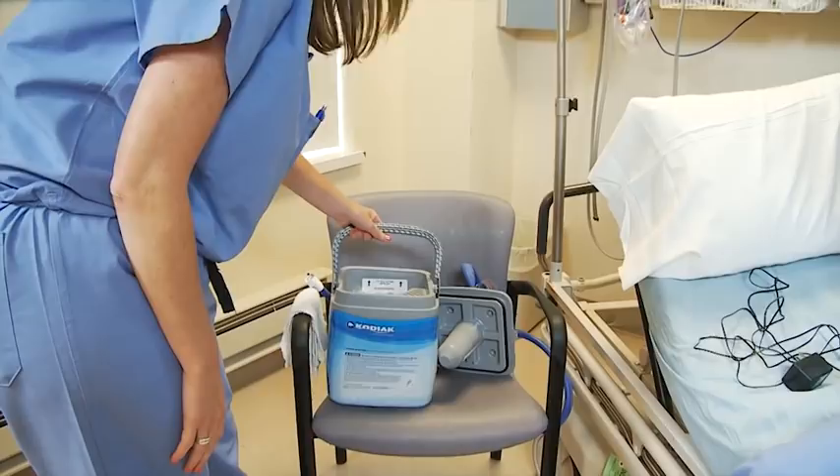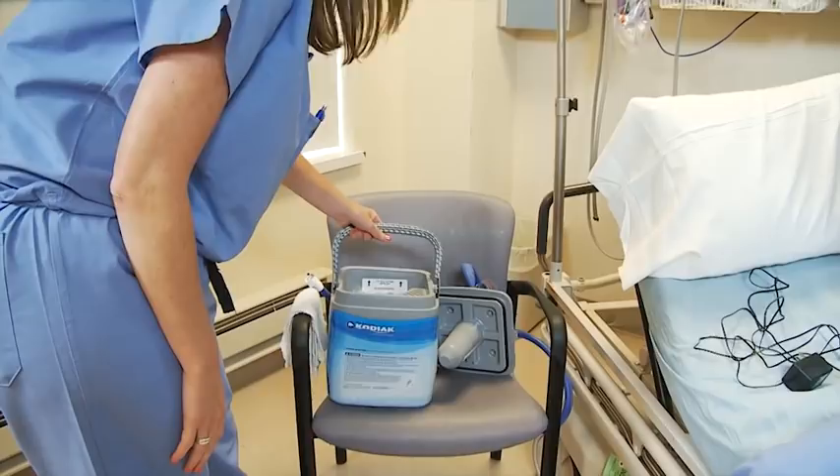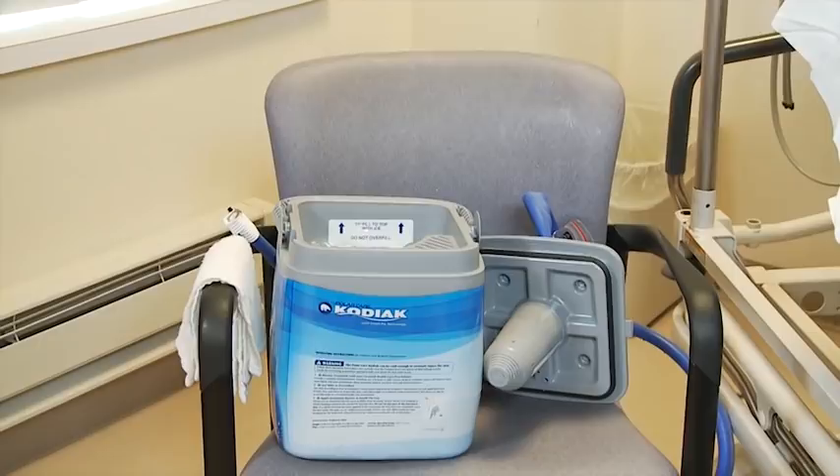First you want to start off by filling the cooler with ice to this line here. You want to add water to the following line. You don't want to overfill it.